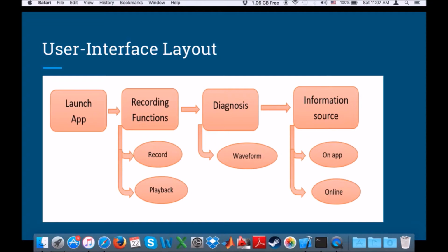In this controller, waveforms of the recorded audio are displayed with implementation by an open source library, FDWaveform. When more information is selected, the embedded web page is accomplished with Apple's API, which is the Application Programming Interface, UIWebView. All the data are passed around the controllers using manually created segues. A segue in iOS is used to define the flow of the app's interface. Now I'll pass it on to Chris to talk more about the signal processing function.